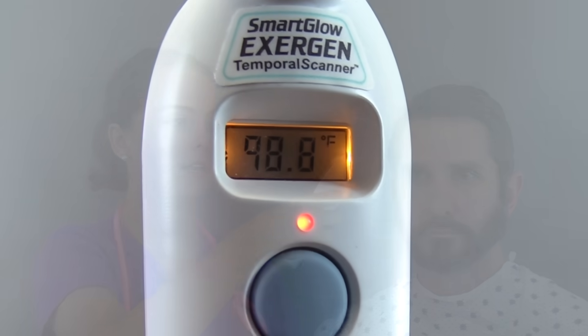We're going to take the patient's temperature using the temporal artery. First, use a probe cover if your device has one to protect it from contamination. Hold the probe flush against the skin at the center of the forehead, then scan it across the forehead to the hairline and look at your reading. Make sure the forehead is clear of any hair or anything, because this probe needs to be making contact with the skin — anything in the way can throw off the reading.